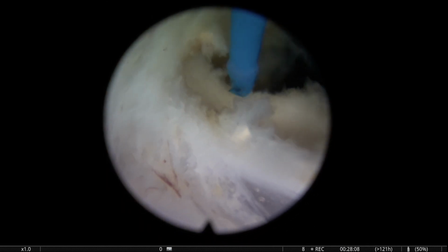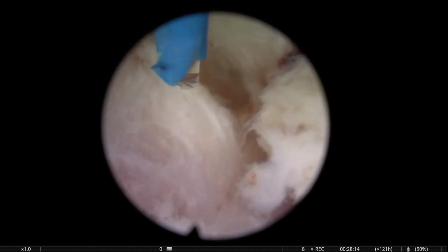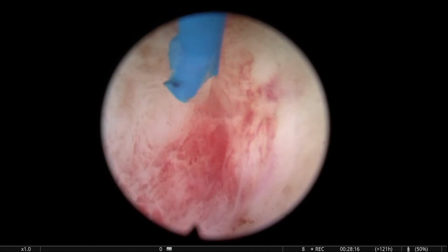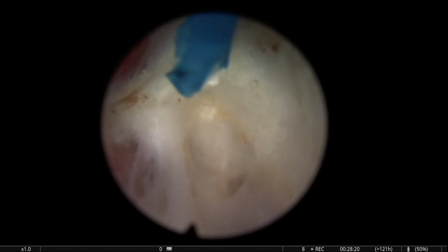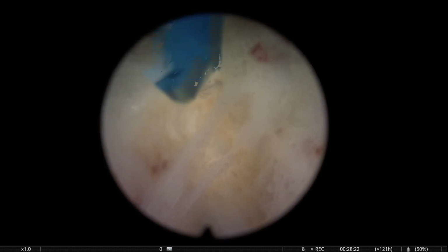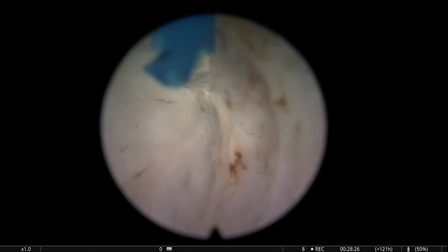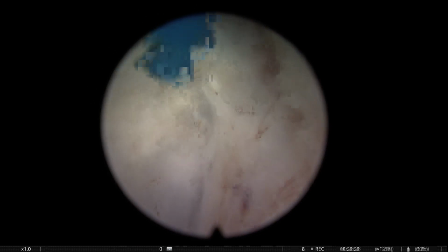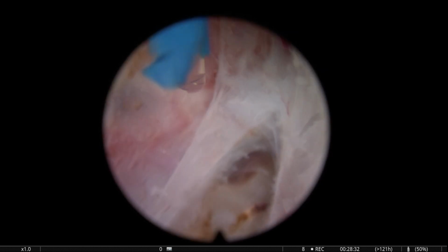These things, if you can keep them reasonably deep, if you don't go too far, they have no consequence. And that's how you adapt to a difficult case, trying to use, of course, a surgical strategy that we all know.